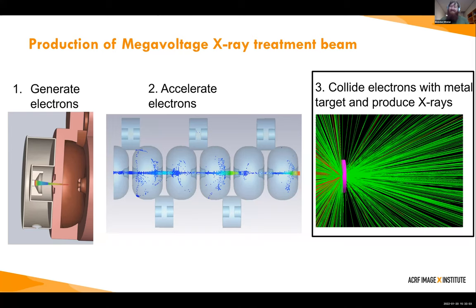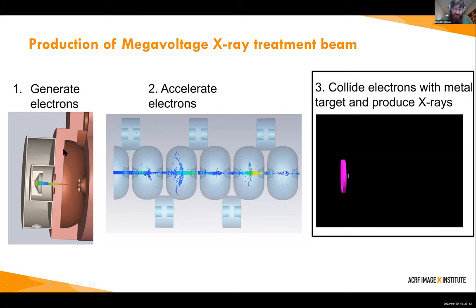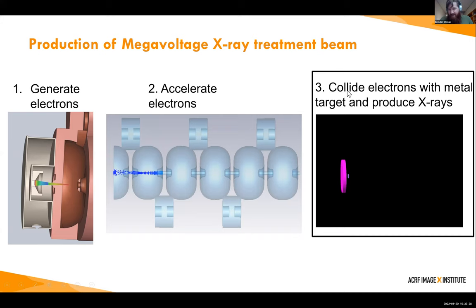We are now two-thirds through our three-part talk. To recap: we start with our electron gun generating a steady stream of DC electrons, which are injected into the cavity. Through the accelerator they go through each cavity getting pushed forward or back depending on timing. Finally we're up to the last part — colliding these electrons with a metal to produce the x-rays we actually want for treatment.